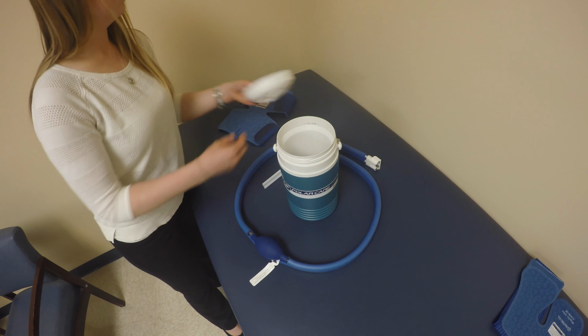and you'll then attach the hose to the unit. There are small nubs that are going to stick off, so you'll line it up to go straight in and then turn to lock into place.